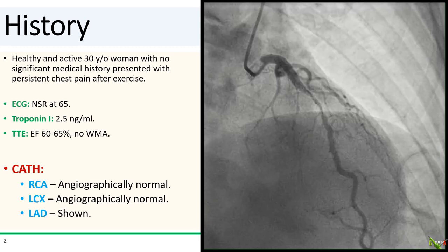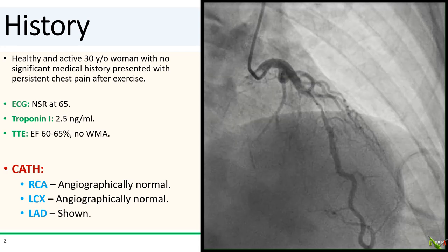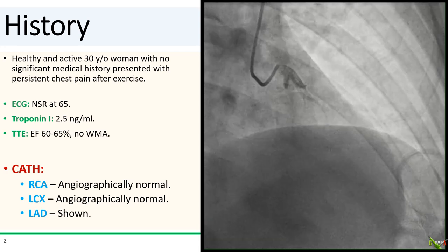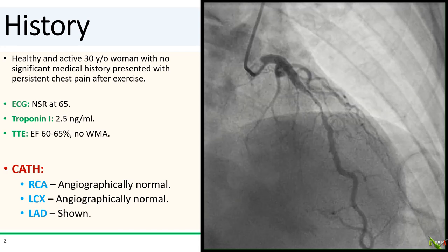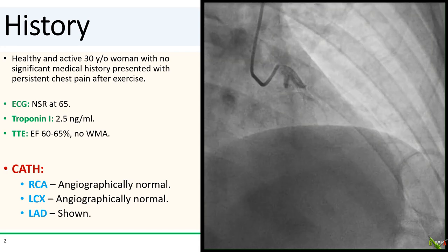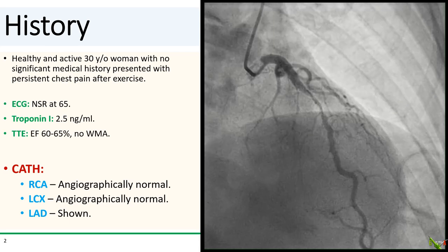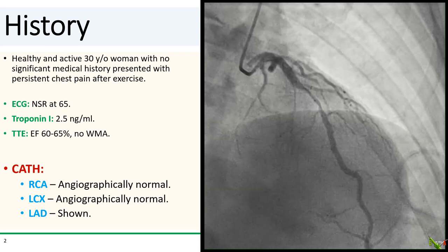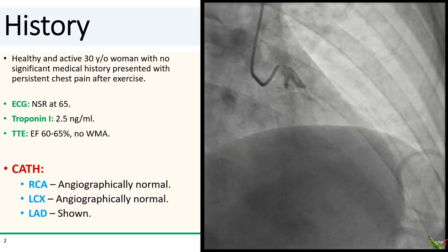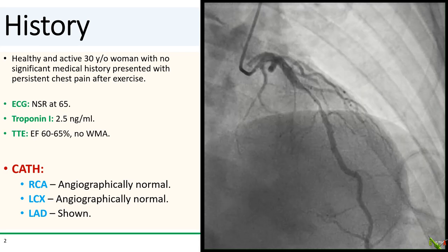On cath, her RCA and circumflex were completely normal. Her LAD is shown here. We see a clear culprit lesion in the high mid-LAD. Let's just stent this juicy lesion and be done, right?